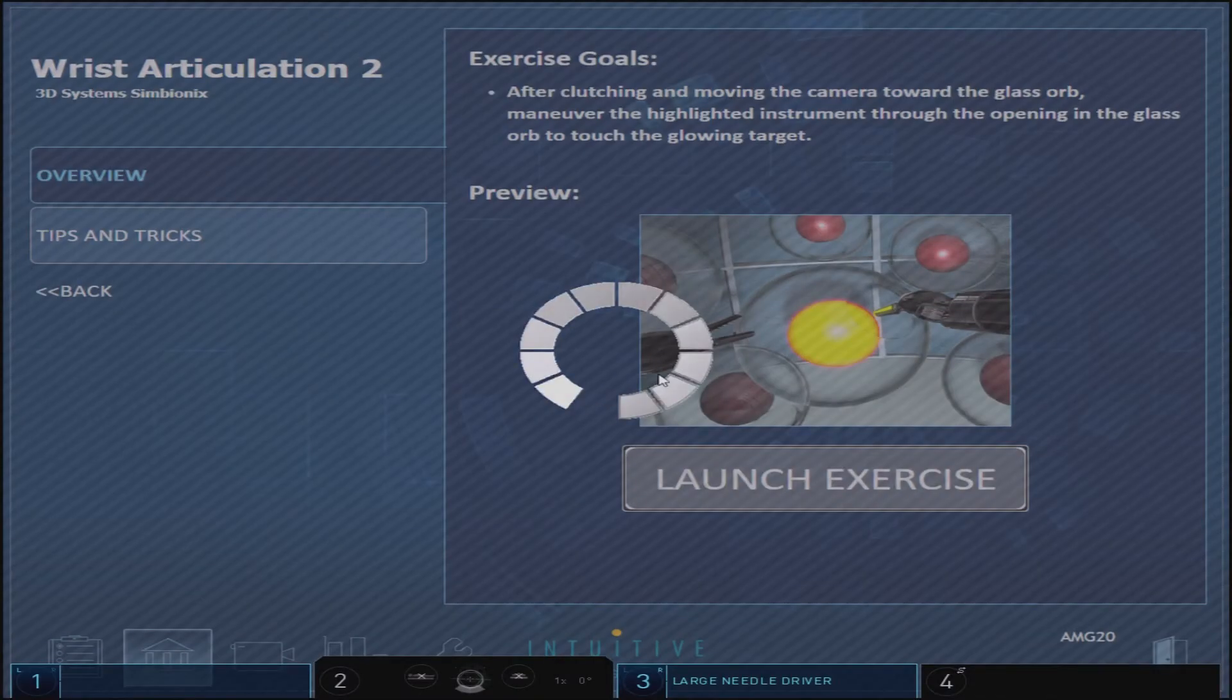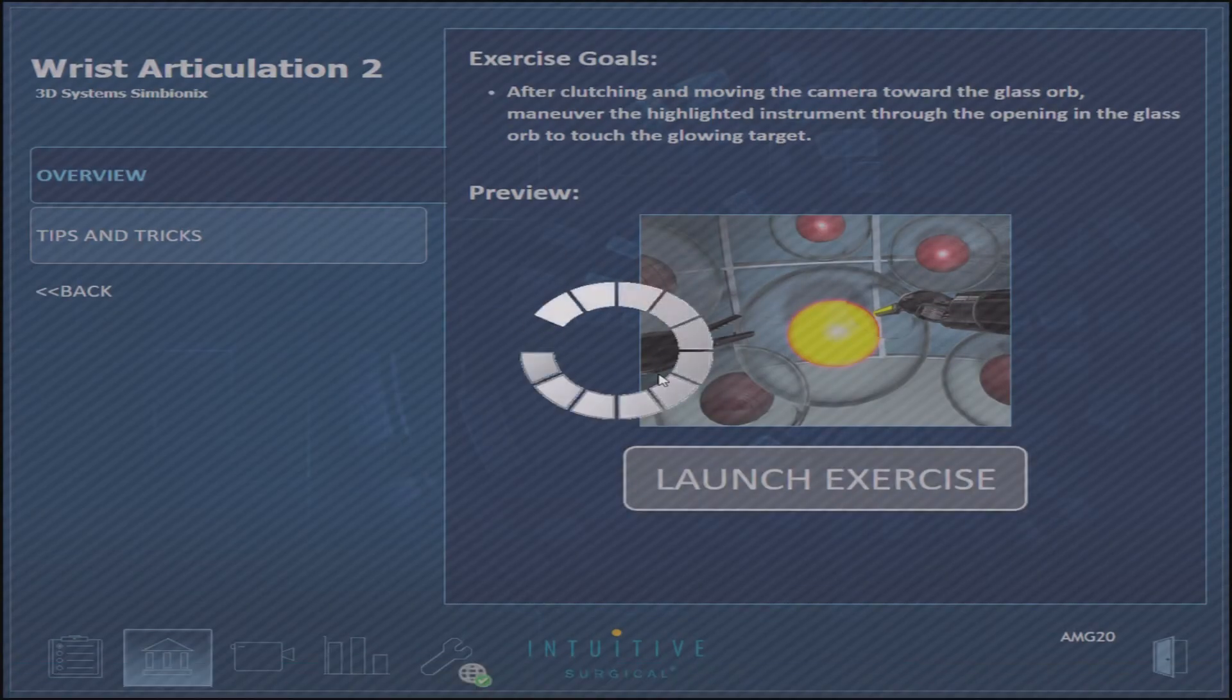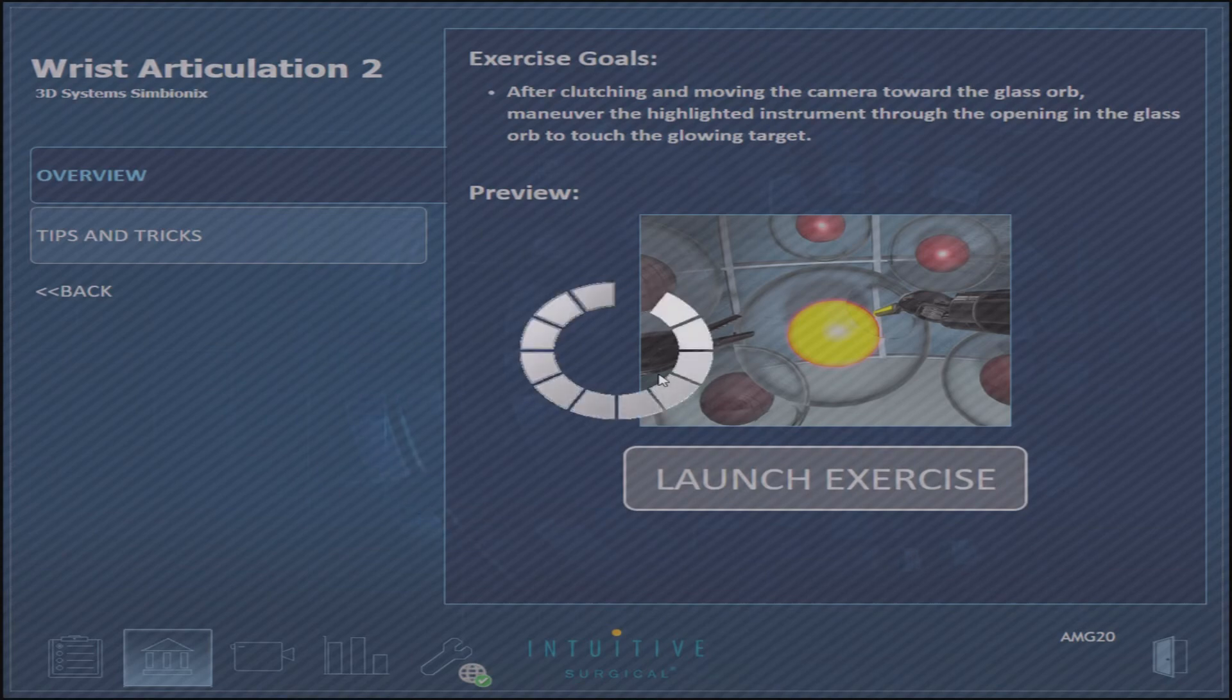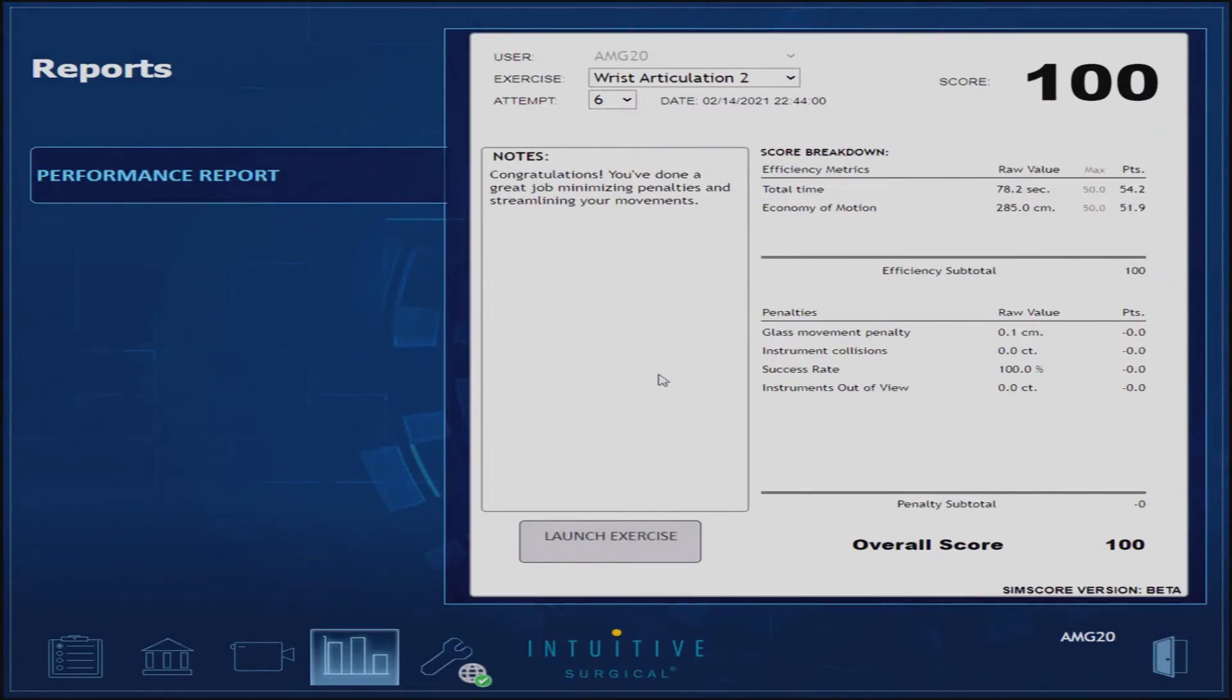Success in this exercise requires good camera coordination, two-arm coordination, and maximizing the degrees of freedom with wrist articulation.